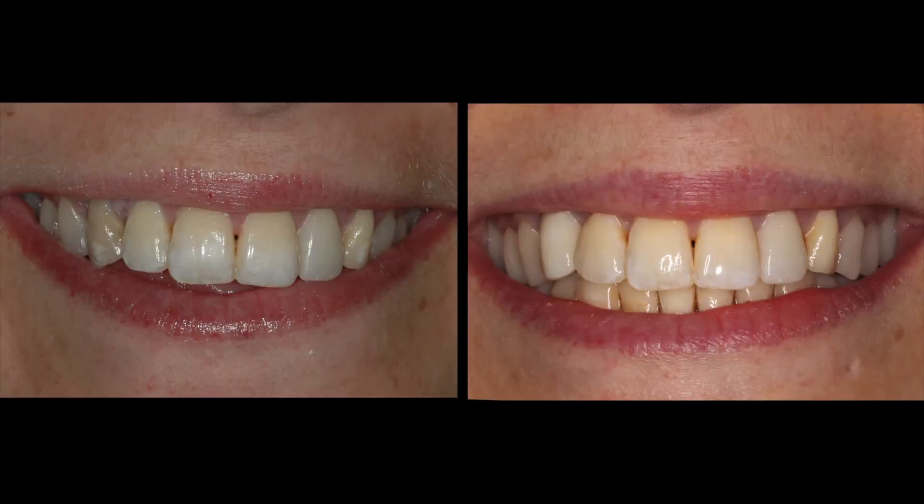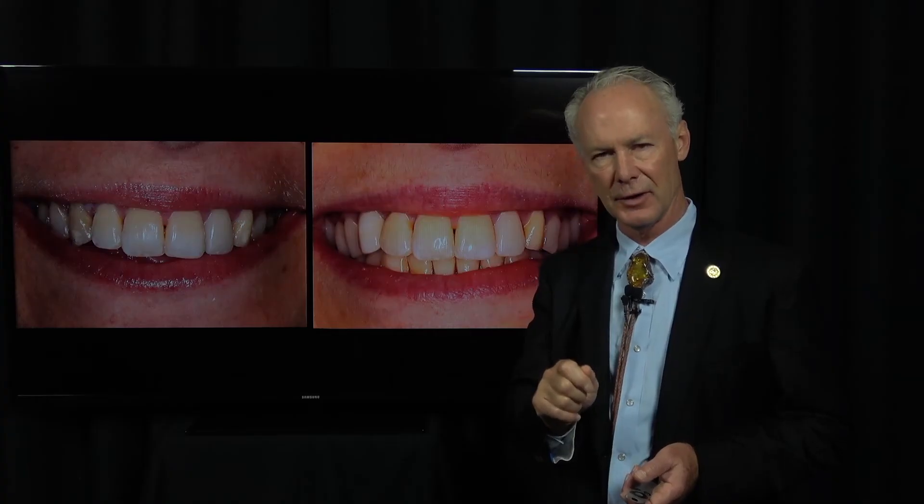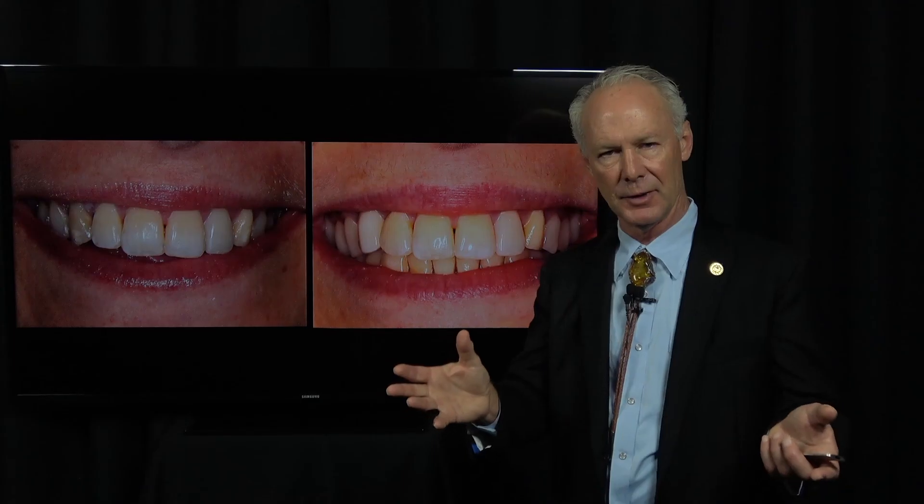The takeaway: when you're screwing in an implant — even if you're screwing in a screw-retained abutment and cementing the crown — torque it to 35 newton centimeters, wait 10 to 15 minutes, then come back and torque it again to 35 newton centimeters after the tissue has had a chance to relax and go back to its original form. This allows the crown to seat maximally. That's the Dental Minute — these procedures work, and they work every time.